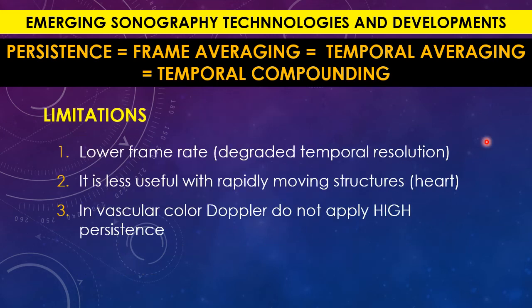So what are the limitations of persistence? First, it will degrade the temporal resolution dramatically. Okay, you will get a low frame rate because each frame will take a longer time to form.